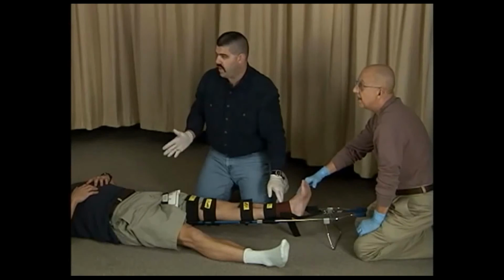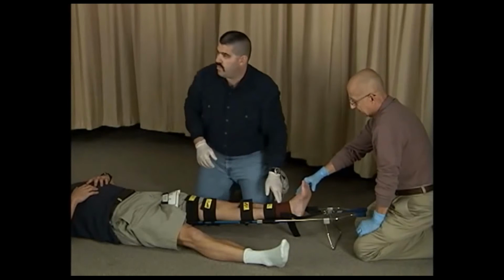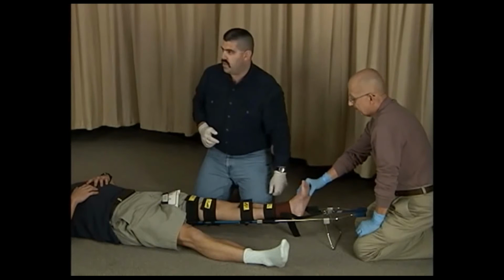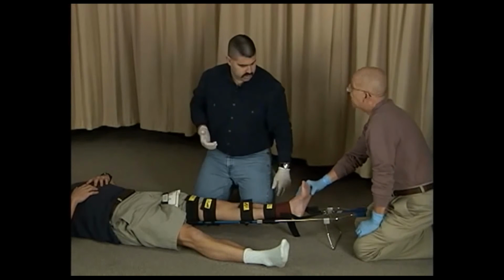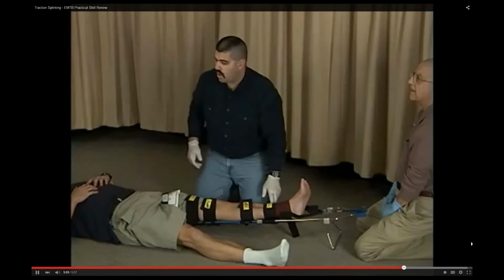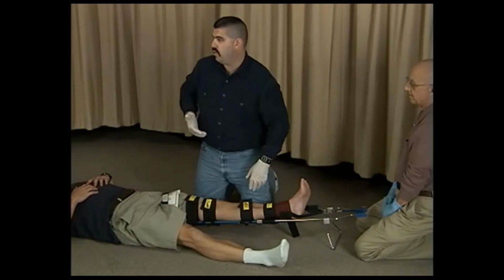Verbalize securing the patient to a backboard for further immobilization during transport to a medical facility. How would you prepare this patient for transport now? I would place the patient on a long backboard, securing the patient to the backboard and then the splint to the backboard. We're going to reassess pulse, motor, and sensory in the distal extremity. Can you move your toes? The circulatory, sensory, and motor functions are present and normal at this time. Reassess vital signs, airway, breathing, circulation, and transport the patient to the closest, most appropriate facility.